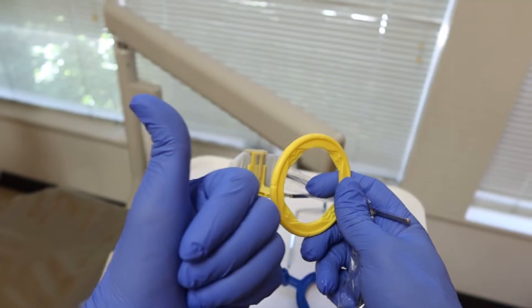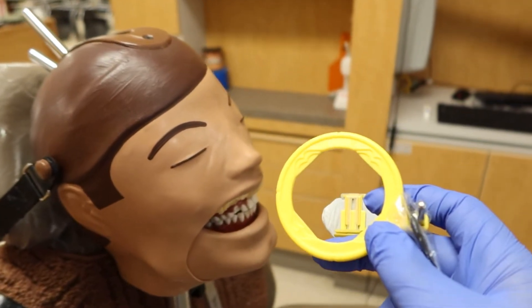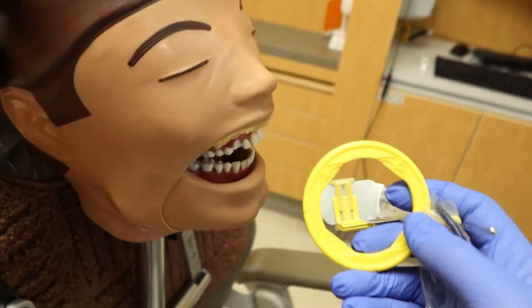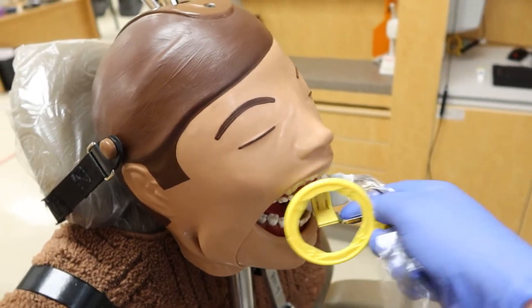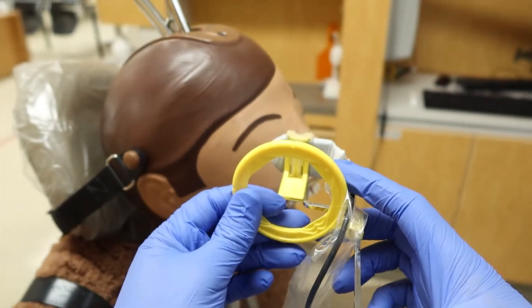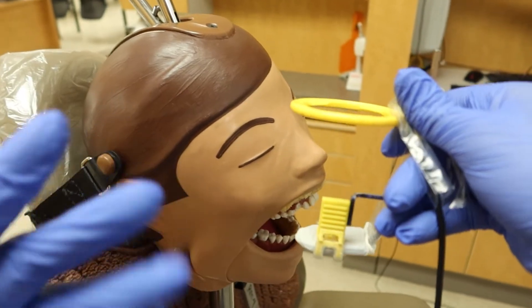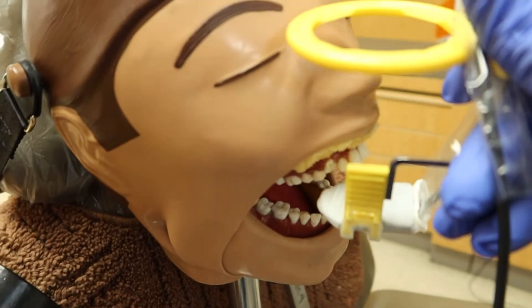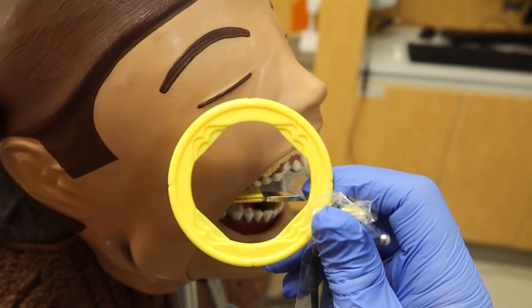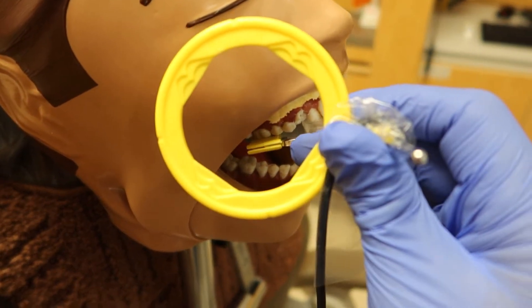Now that the x-ray equipment is prepared for the upper right, let's show Blay what we've got. So now we have our x-ray — don't worry, it's not gonna hurt. Just open really big, like a lion. Before I start jamming it in there, I'm going to gently bring the ring back to give myself some playroom for the cheeks. I'll keep it horizontal as I put it in — that's the key part — then gently roll it into place for a comfortable fit.